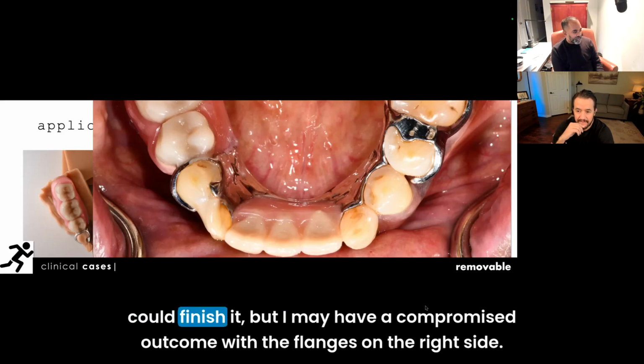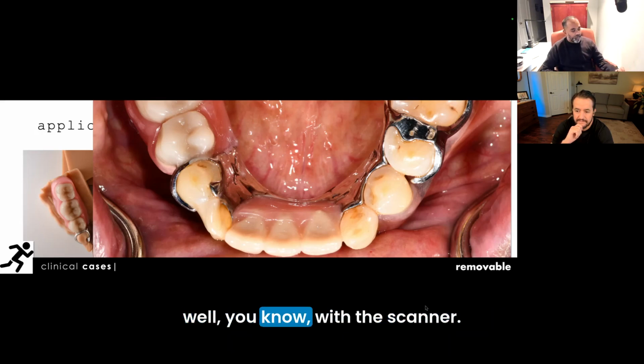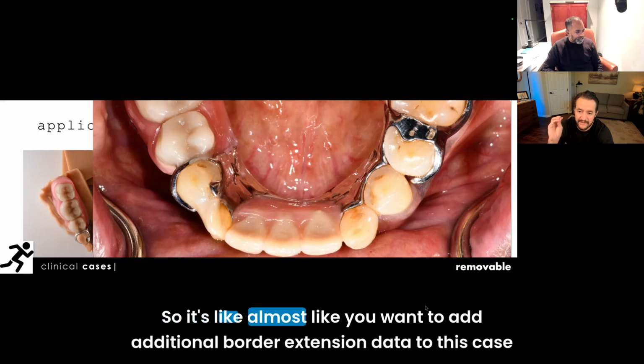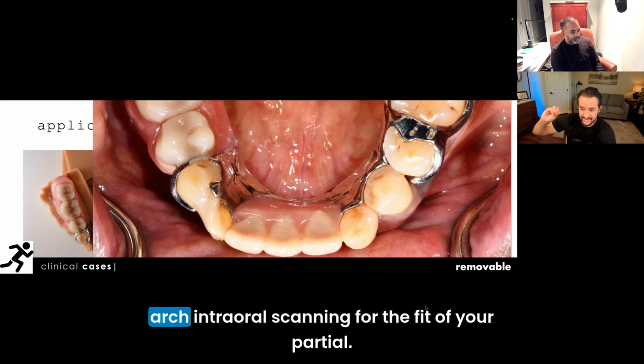And I could finish it, but I may have a compromised outcome with the flanges on the right side. So how can I now basically do something to record the part that I didn't really get well with the scanner? It's almost like you want to add additional border extension data to this case so that you're able to extend the borders, but also utilize the benefit of the cross-arch intraoral scanning for the fit of your partial.